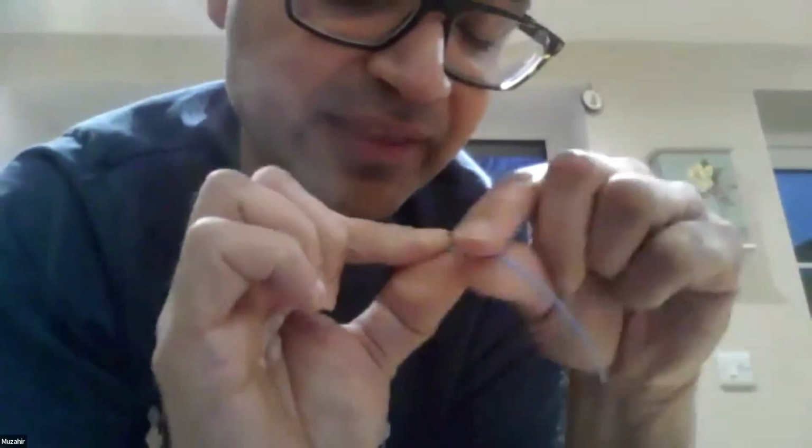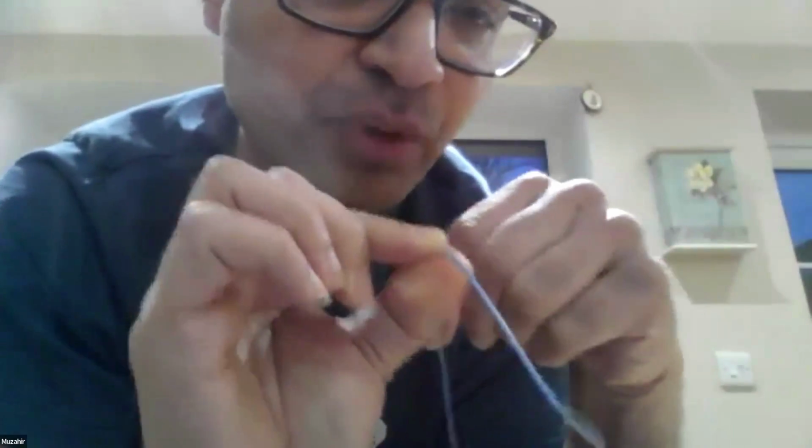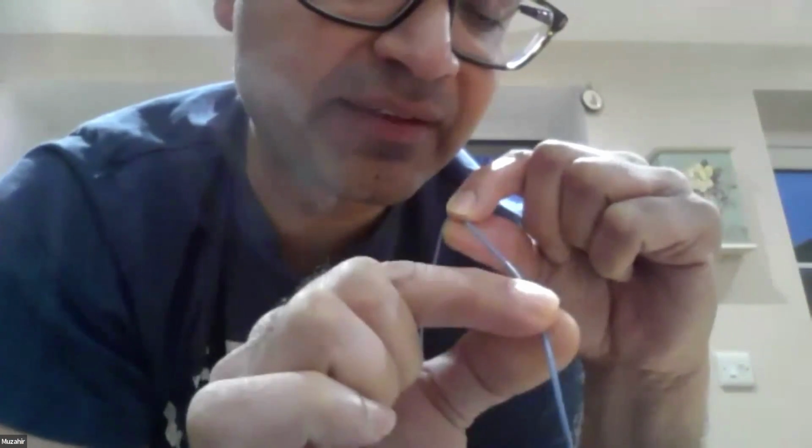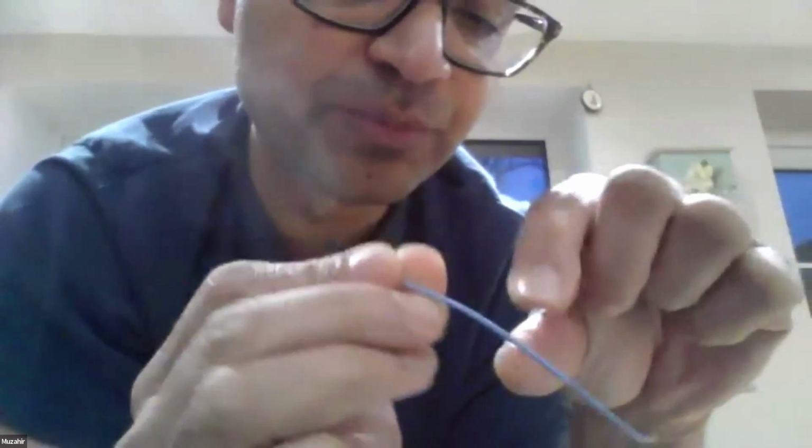Now, these catheters generally pass through most guiding catheters. So you would use essentially the telescoping technique of having the guide wire, guide catheter, and as you push the catheter across, the guide wire will then telescope into the structure.